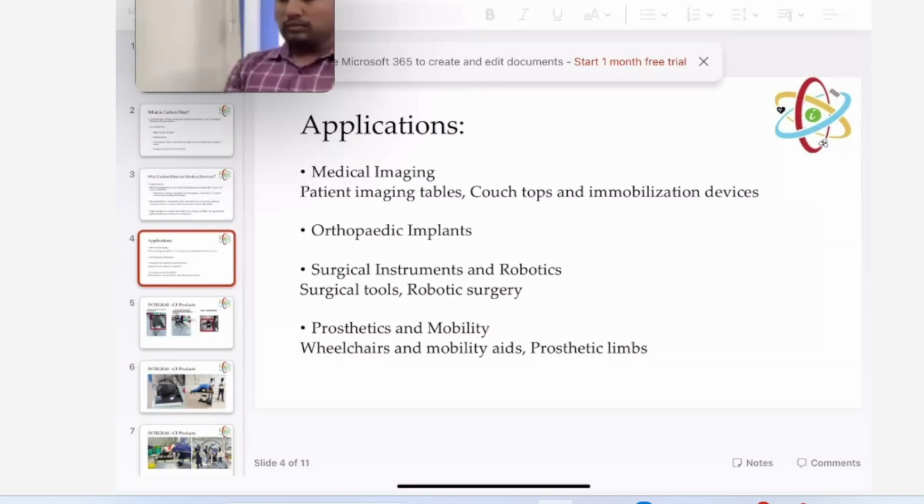Again, it will give more scatter radiation. So to get a better image of my femur, my abdomen or my knee, I need to increase the power of my machine, the generator in the C-arm or X-ray machine. Once I increase it, it produces more radiation, which hits that wood top and then goes to the patient's body. So what is the main disadvantage of using this wood? It gives more scatter radiation, so you need to generate more radiation than the required amount.